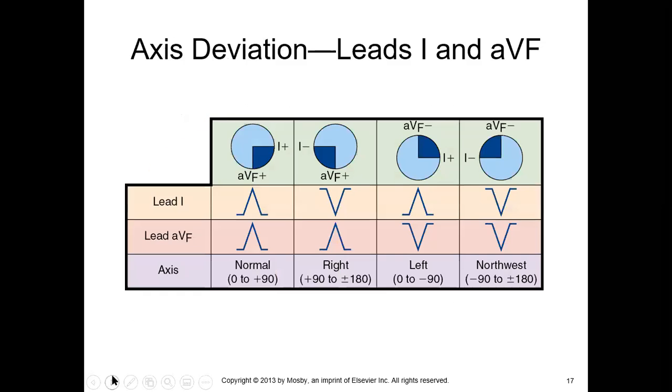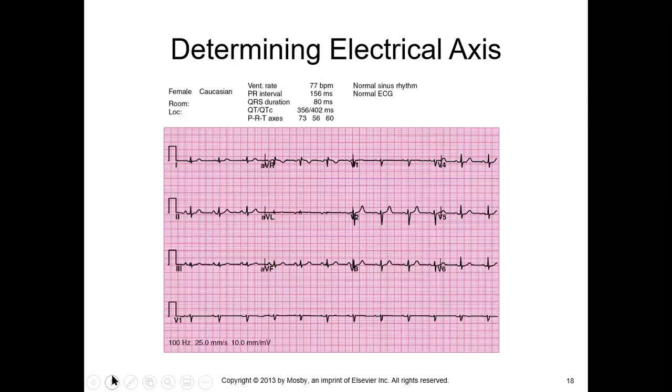Let's go back. Lead 2, where's lead 2? Lead 2 is perpendicular to aVL.